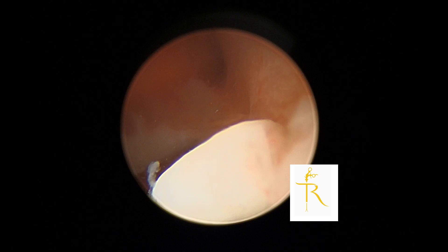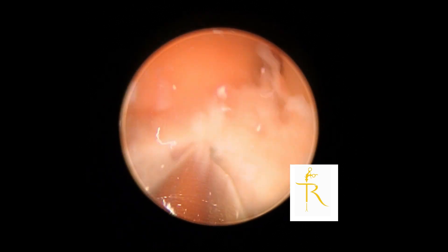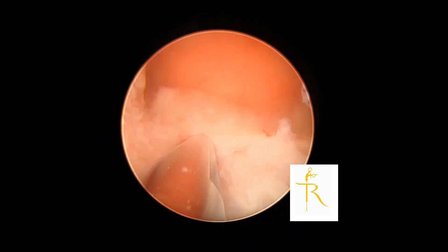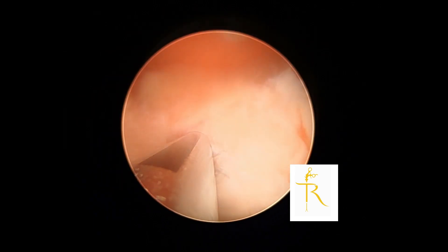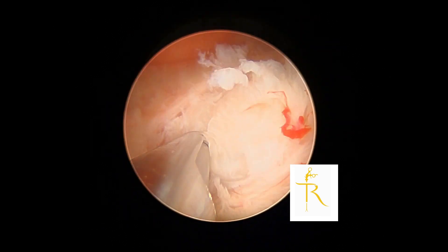As you can see, the fibroid has a different texture. You can get some tactile feedback with the mechanical morcellator — it's a bit hard, not soft, with a gritty sensation. There are visual cues as well: you can see it's a bit whiter than the surrounding pink mucosa, which reassures me that I'm actually morcelating the fibroid.